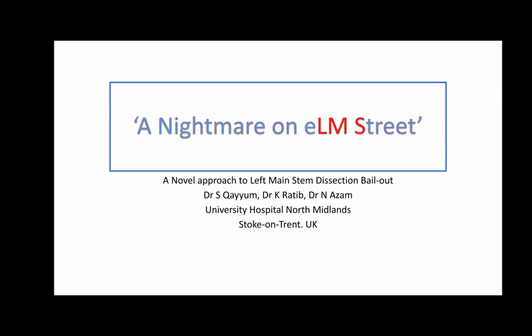I think there was a Japanese study which looked at OCT versus IVUS for investigating left main stem lesions, and 100% of the time the IVUS gives you the information that you want, whereas only 95% of the time can you get the information with OCT. It also depends on what information you're looking at. Here there were two different questions.